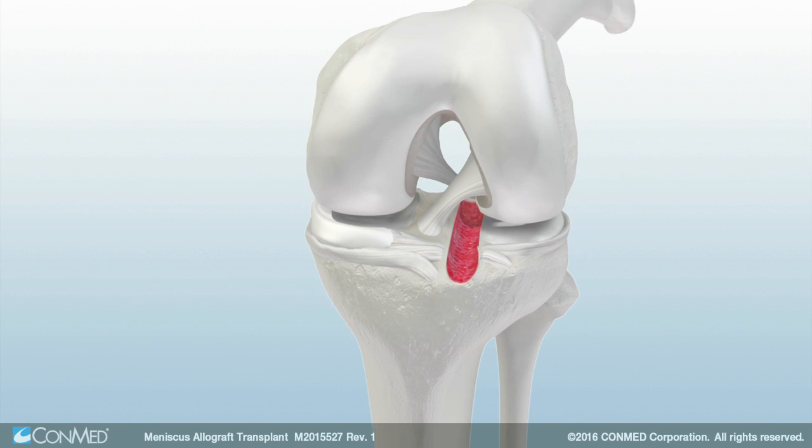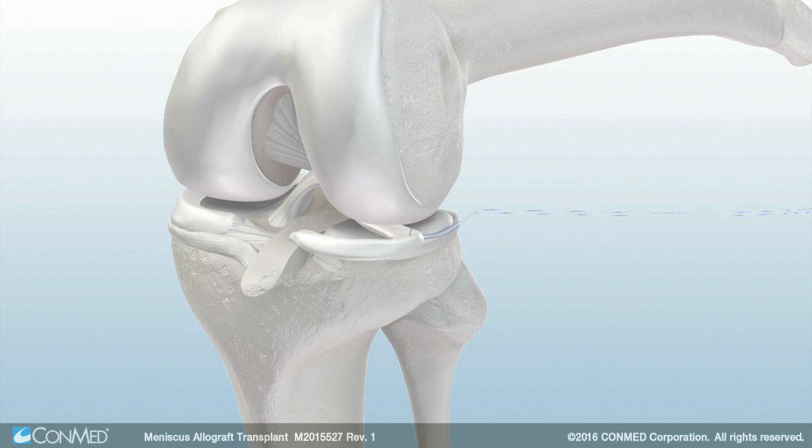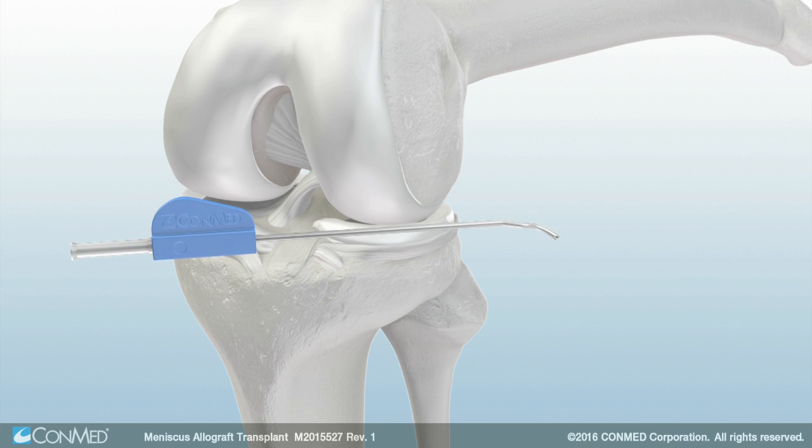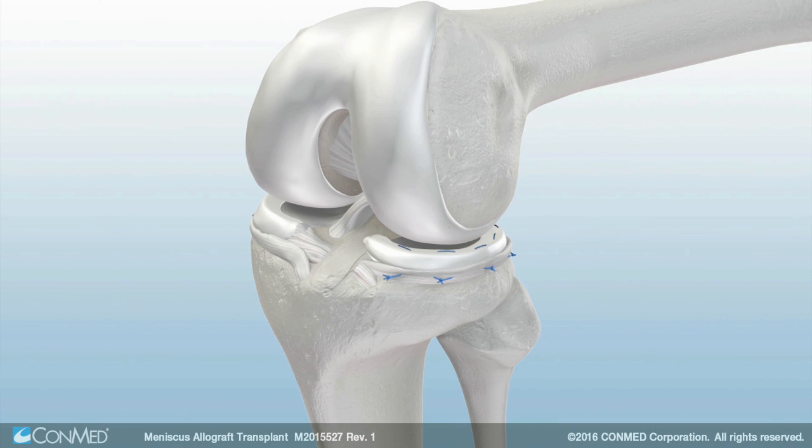To prepare the graft for insertion, place a 2.0 hi-fi suture through the junction of the posterior horn and the body of the meniscus. Then pass the suture through the posterolateral portion of the joint capsule. Pull tension on the suture to pull the meniscus allograft under the femoral condyle. Finally, use zone-specific cannulas and hi-fi double-arm needles to fix the meniscus. To ensure stability, suture the meniscus around the remaining rim in the order shown. This completes the meniscal allograft transplant procedure.